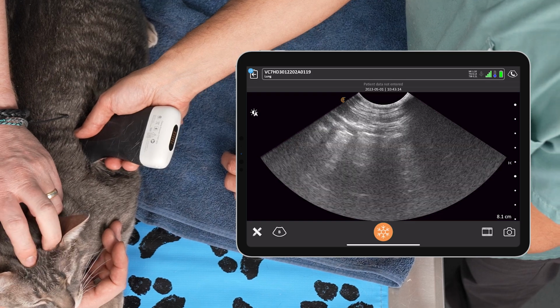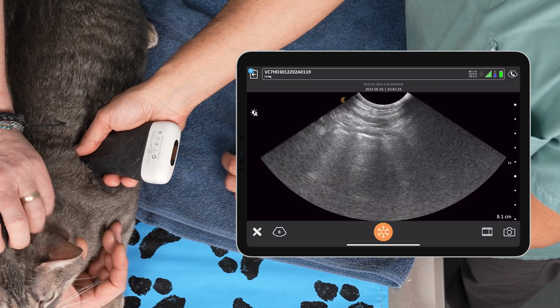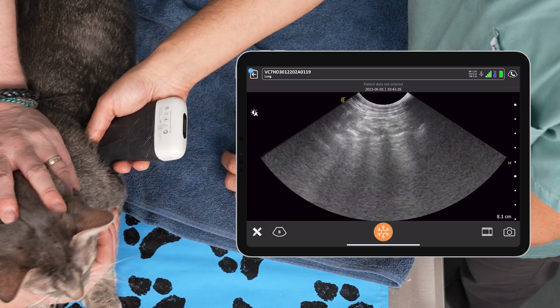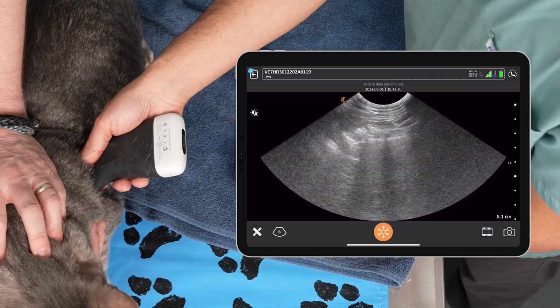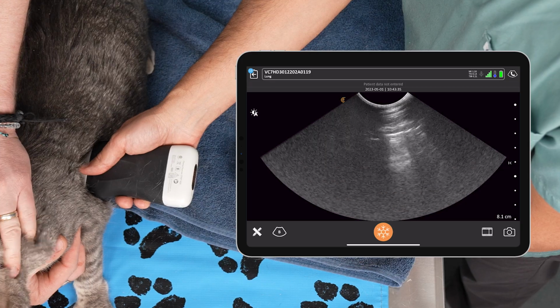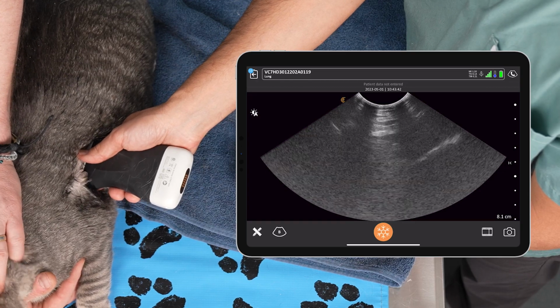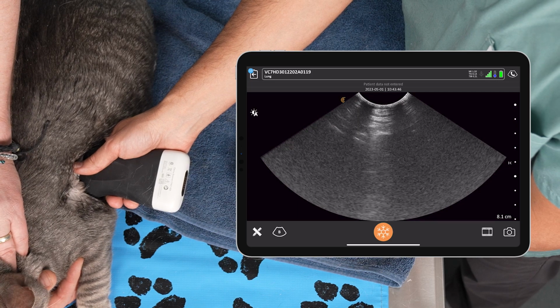So now I am caudodorsal, so I'm going to start sliding the probe and looking at that lung surface for either B lines or consolidations. And we do this pretty quickly, Dr. Boysen. Absolutely, and we're going to scan that dorsal third until we hit that front limb, right there, which will stop us, like Serge has reached now. We didn't see any B lines or consolidations, so at this point now, Serge is going to go to the mid-thoracic region, again looking for B lines and consolidations as he goes more ventral. That's right. We didn't see any, and then at that spot, he's going to come back, and this is where the chest gets even smaller, so he's going to hit that curtain sign very quickly, like you see here again.